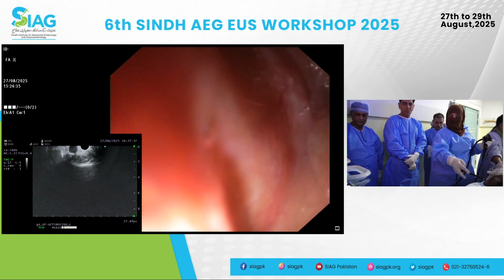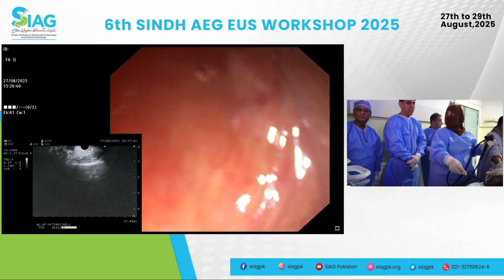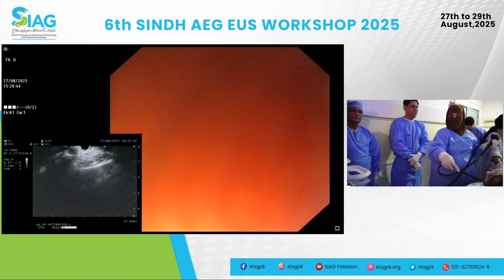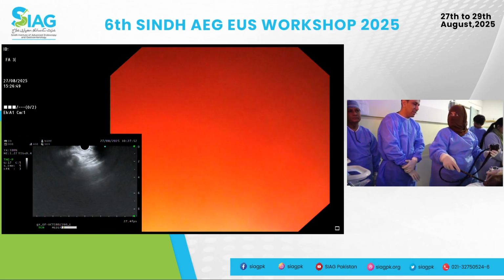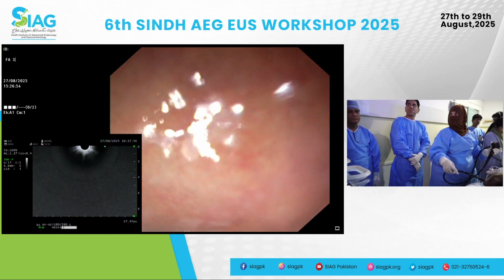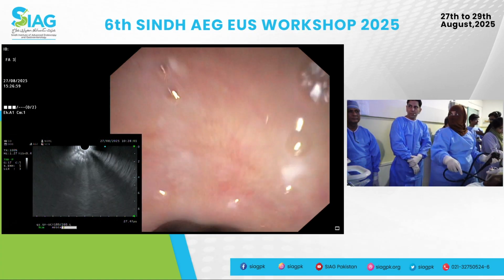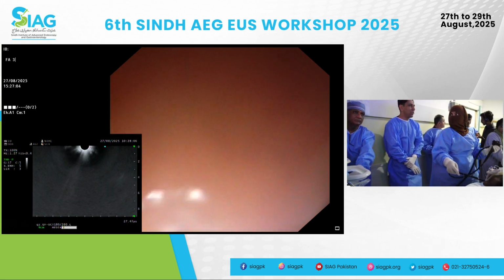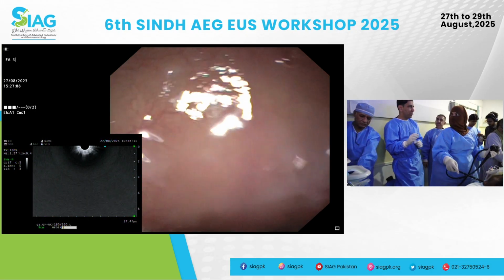Good. Now we are in the esophagus. Okay, so gently advancing. Excellent, good. So examination, whether you're doing mediastinum or pancreatobiliary examination, should always start at the GOJ, the gastroesophageal junction. So keep going. Good, excellent. So at this stage, you should make a habit of making a mental note of where the GOJ is, even if you're doing diagnostic or therapeutic procedures.